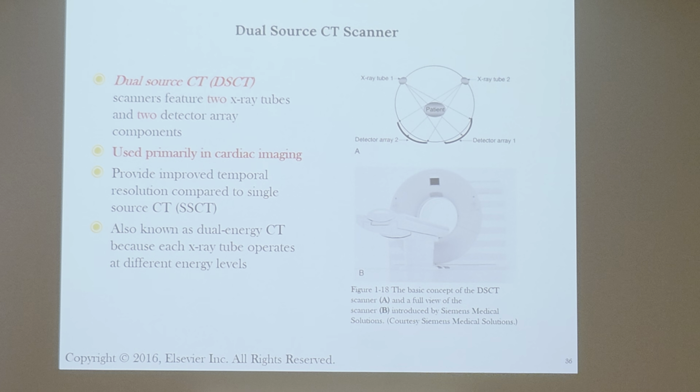Well, remember, it's all going to be reconstructed. Are you asking whether this is likely going to have a different type of algorithm than one without the dual detector? Then yes. As long as it's acquiring data, the energy is going to be emitted and then converted into digital, but it depends on the algorithm to determine how to put those into the pixels so that you're not getting a mutated type image because of the different angles of the two.